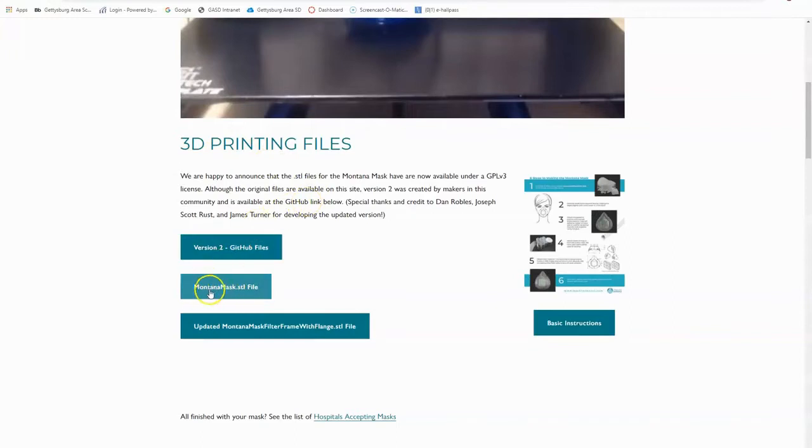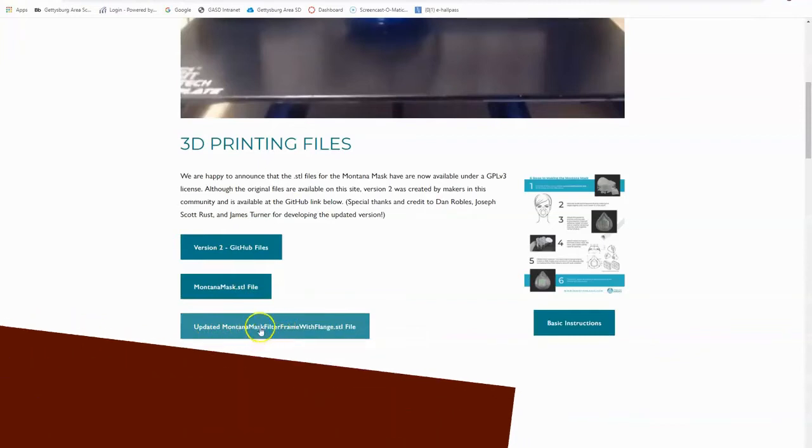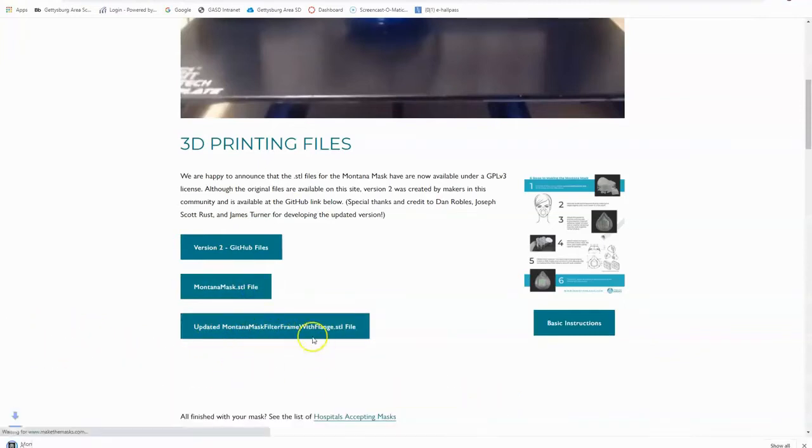I'm going to go ahead and download the Montana Mask STL file and also the updated Montana Mask filter frame with flange. By doing this, I'll then have the STLs that I can take and put into Repetier-Host to be able to create the code.